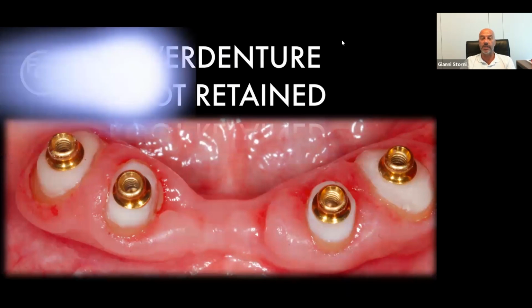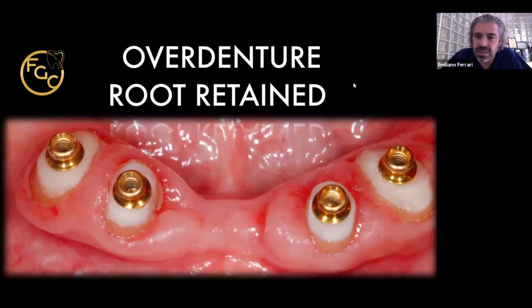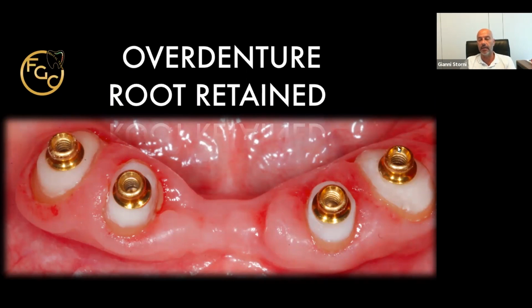So we start with the first case. Finally, it's a clinical solution. So Dr. Emiliano will explain to you step by step what he's doing using this case. You can see, before I leave, that inside every Equator, you will always have a thread that can be used. So Emiliano, you can go ahead, please.